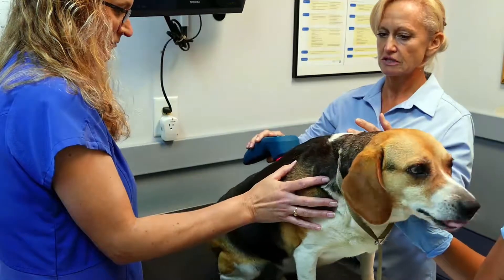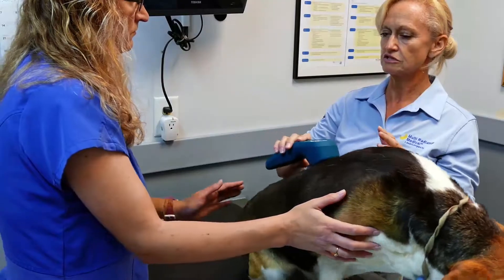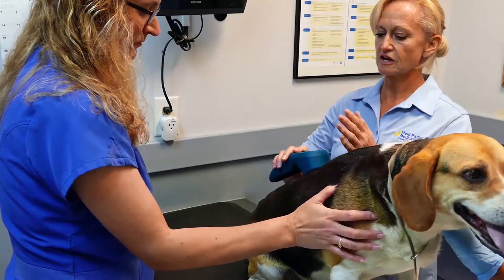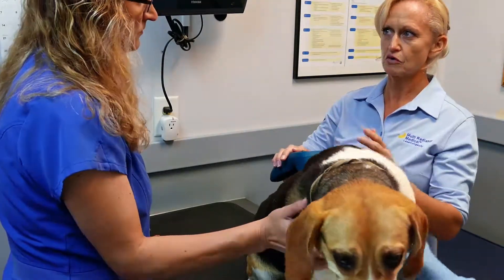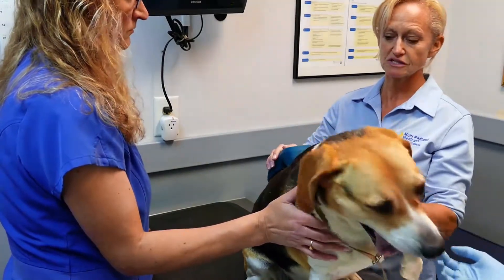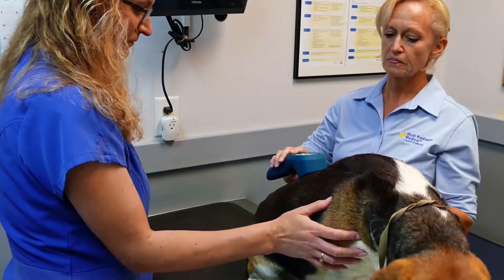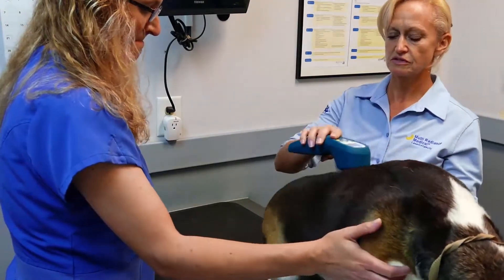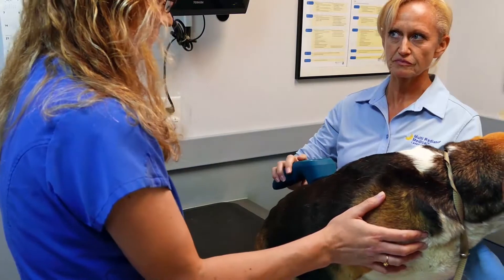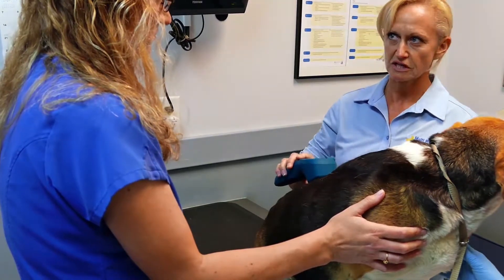Each time you approach the animal, whatever it may be, your first question is going to be: am I trying to just stop pain? Am I trying to just take away inflammation? Once you've decided on that factor, then you can decide a setting which is appropriate. All of the settings under 500 Hertz are for stimulatory slash healing treatments. All the settings over 500 Hertz are for inhibitory.